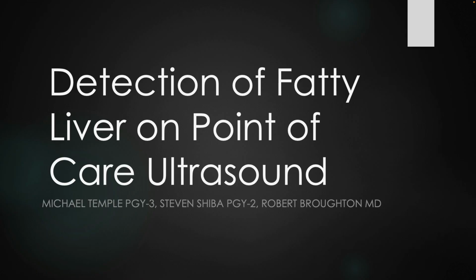My name is Michael Temple. I'm one of the third-year internal medicine residents here at the Medical College of Georgia and one of the second-year ultrasound fellows. Today I want to talk about detection of fatty liver on point-of-care ultrasound.